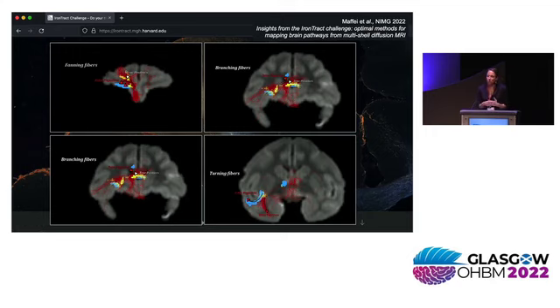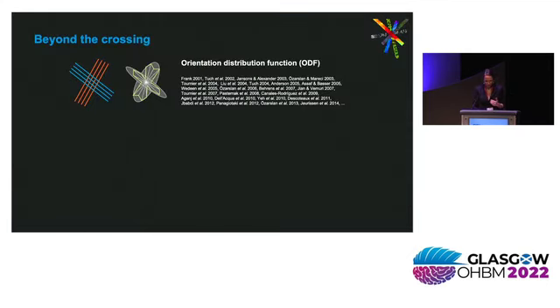So it's important to note that crossing fibers here will exist everywhere along these fiber bundles. But the consistent errors across different analytic pipelines don't occur just anywhere. They systematically occur in these areas where the fiber configurations actually diverge from crossings. Where does this come from? And is it something that will ever be solved because our data, diffusion data, will improve?